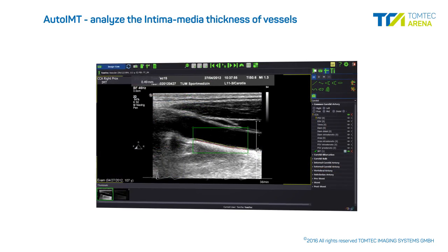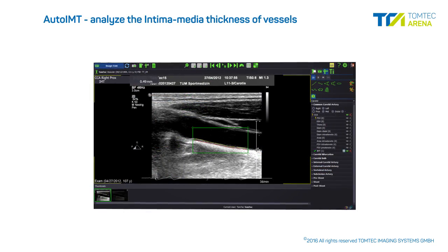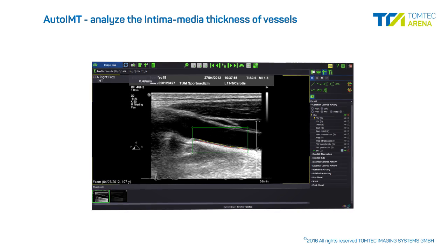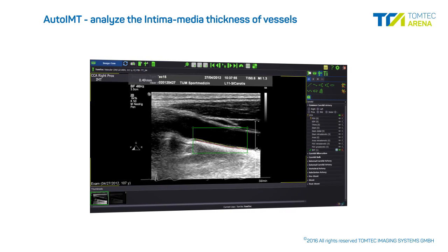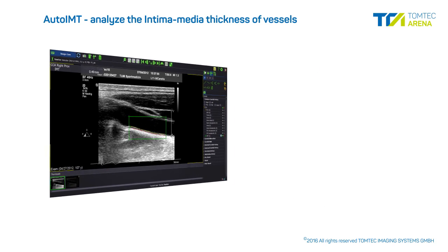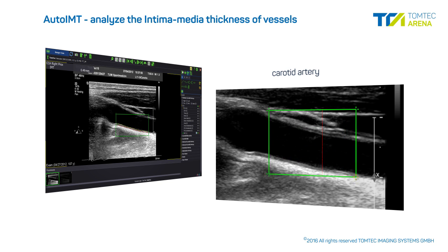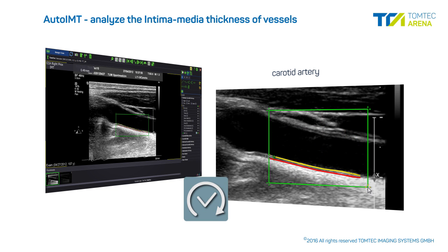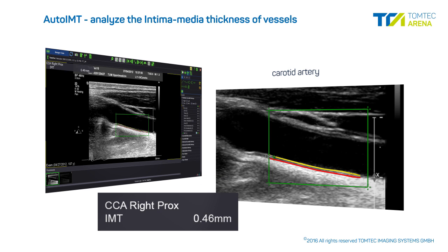AutoIMT is a fast, intuitive, and reliable method to analyze the intima media thickness of vessels such as the carotid artery. By defining a region of interest on a vascular long axis view, AutoIMT automatically calculates the mean intima media thickness. Measurement values are automatically transferred to the measurement worksheet.